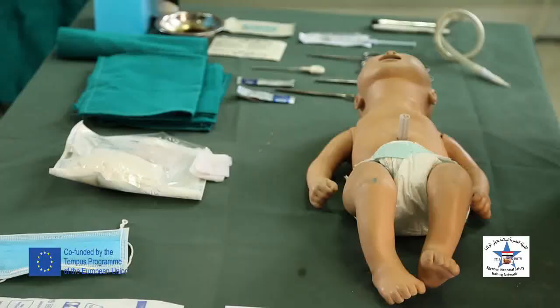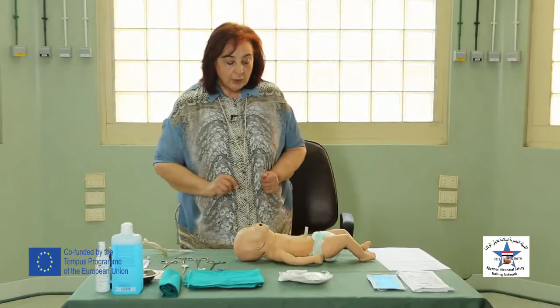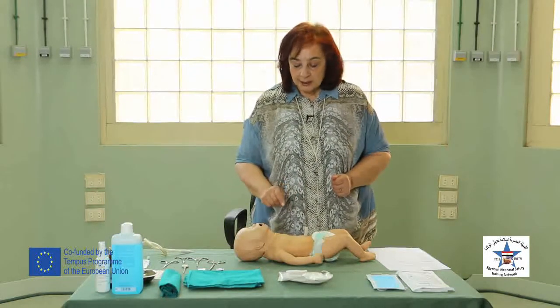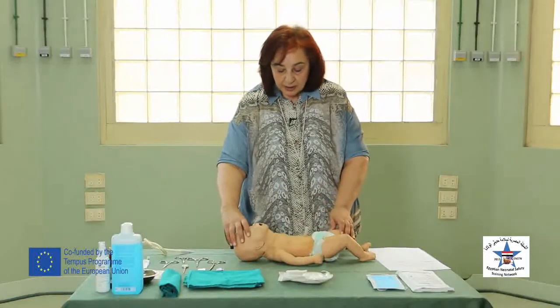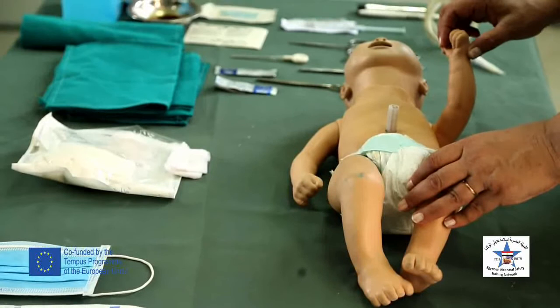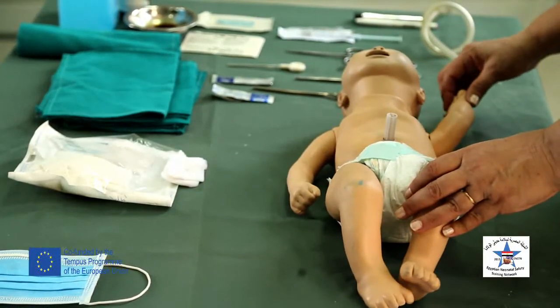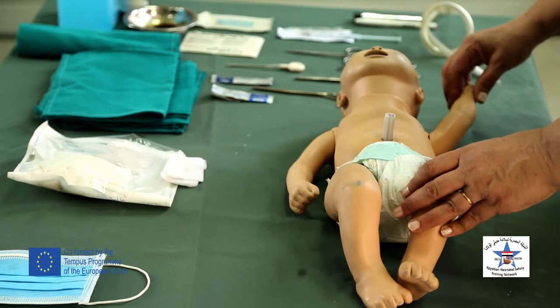Procedure should be carried out under complete aseptic condition. I will position the baby and I will identify the site of insertion of the chest tube. I will position the baby in the supine position with the hand on the affected side placed superiorly next to the head of the baby and supported there, either by a strap or the assisting nurse.